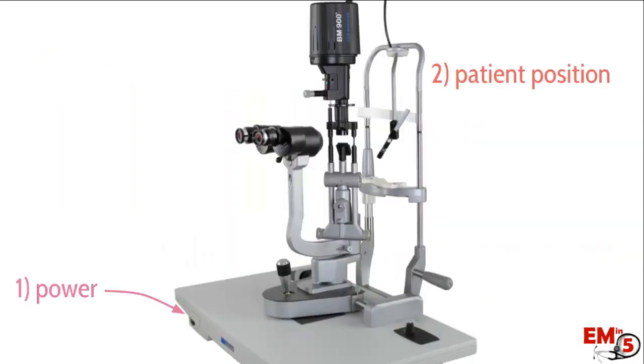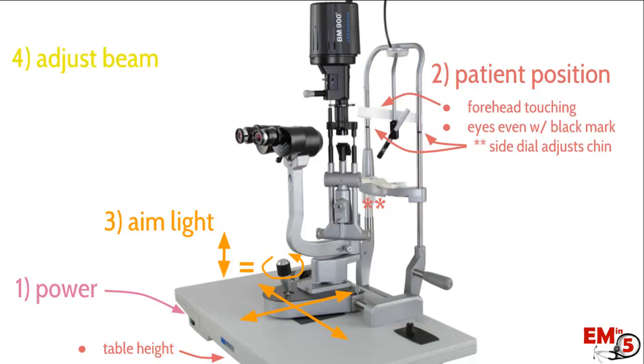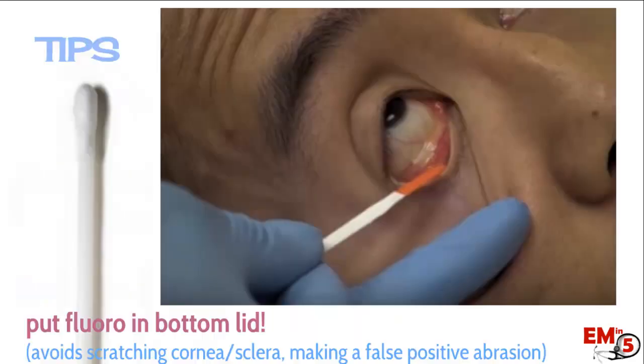Let's review. Power button. Adjust the patient: table height, forehead touching the white strip, eyes even with the black lines by adjusting the chin rest. Move the light up and down and back and forth with the joystick and the base. To adjust the beam: use the intensity dial, adjust the width, and the height dial maxed out gives you cobalt blue for the fluorescein. Adjust the beam vertical or horizontal by rotating the top of the machine. Don't touch the extra switch — the green filter is not the same as cobalt blue. Start with the lowest magnification.